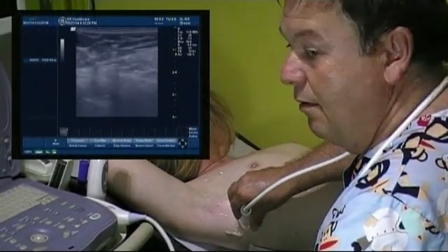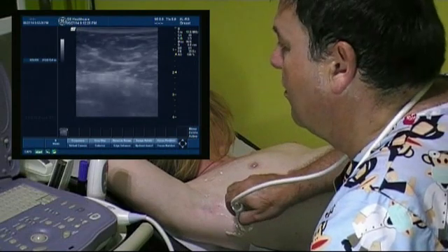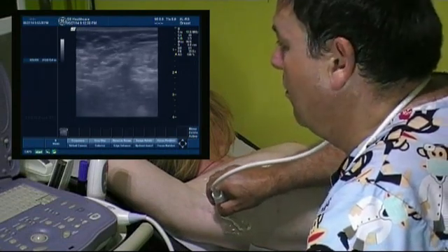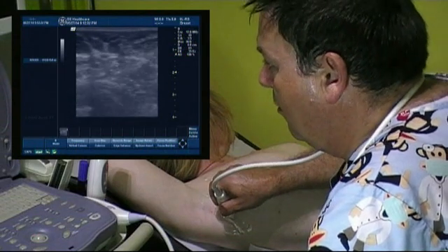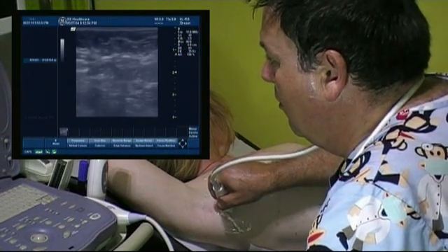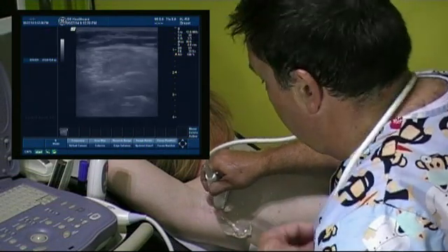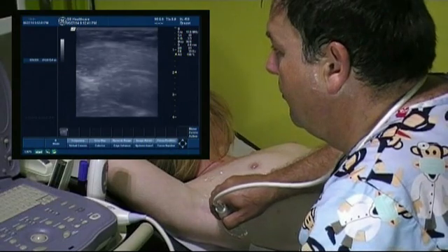To scan the axilla, we start by scanning in a transverse direction to the level of the fourth intercostal space between the mid-axillary and posterior axillary line. We scan upwards, level 1, until we see the axillary vein and the head of the humerus.